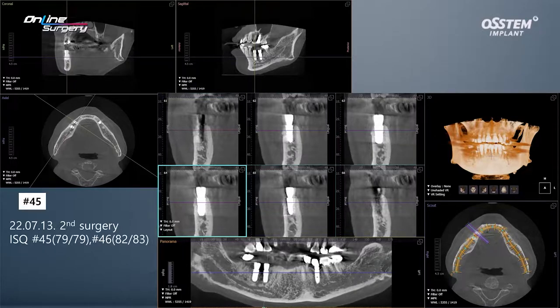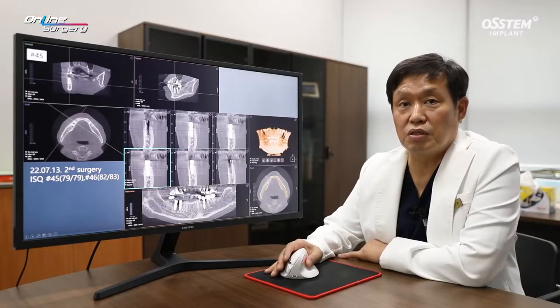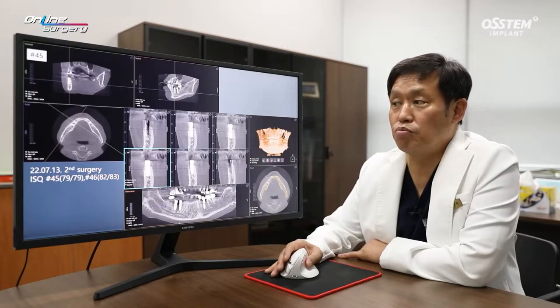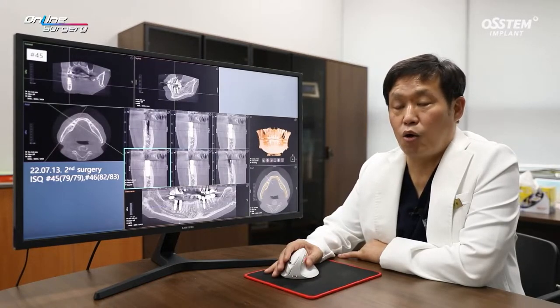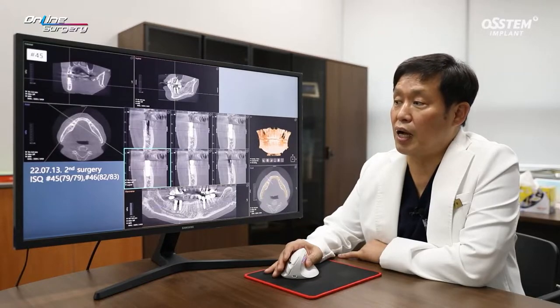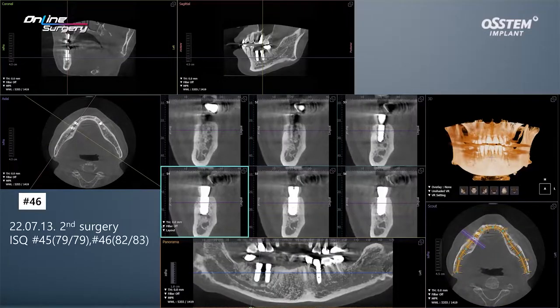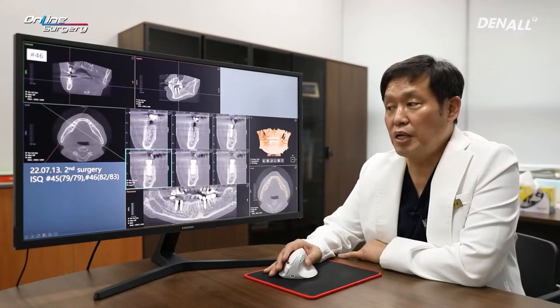The ISQ was about 79 because BA surface was used in the area where socket preservation was done. After 2 months, a favorable ISQ value was achieved in number 46. The buccal bone is not fully consolidated, but on CT it is well maintained. The ISQ value was 83 and 82, which was quite favorable.